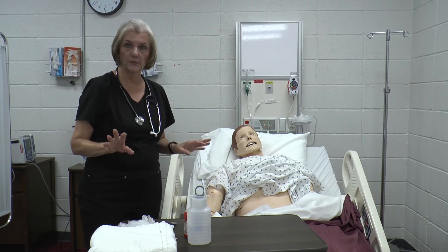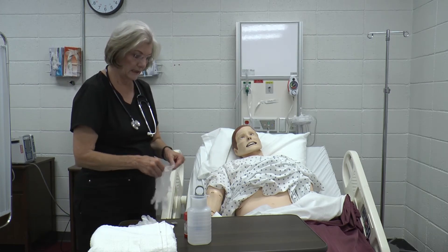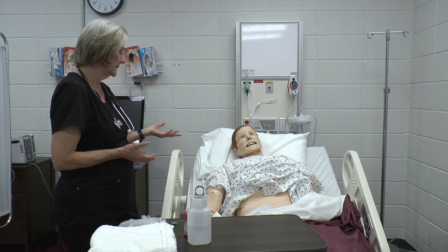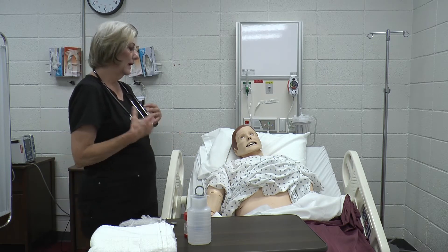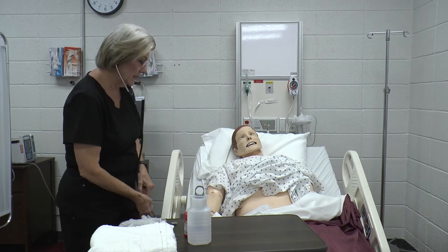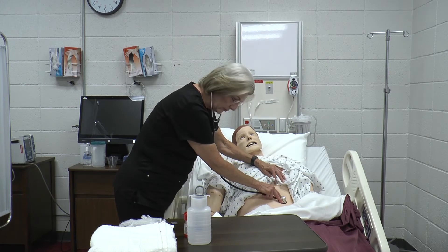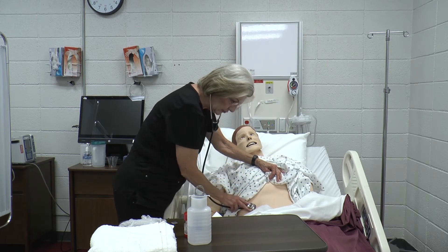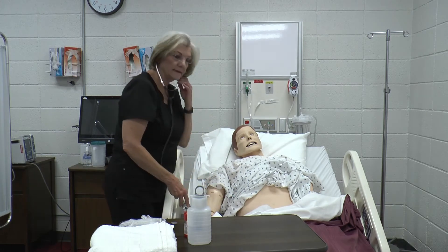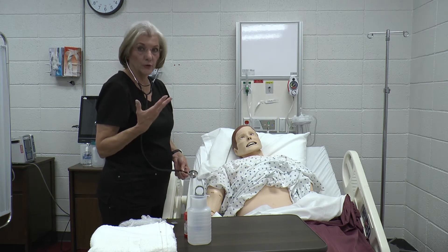All of your standard steps apply. You would come in and tell him who you are and say, 'I've got some meds to give you per tube, let me do some checking here first.' You would want to check bowel sounds in all four quarters to make sure he's got bowel sounds, because if he doesn't have any bowel sounds, he's not going to be able to pass that med and absorb it.